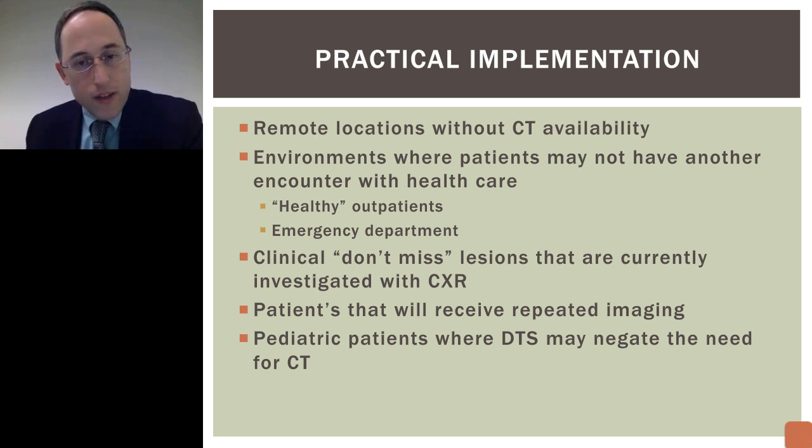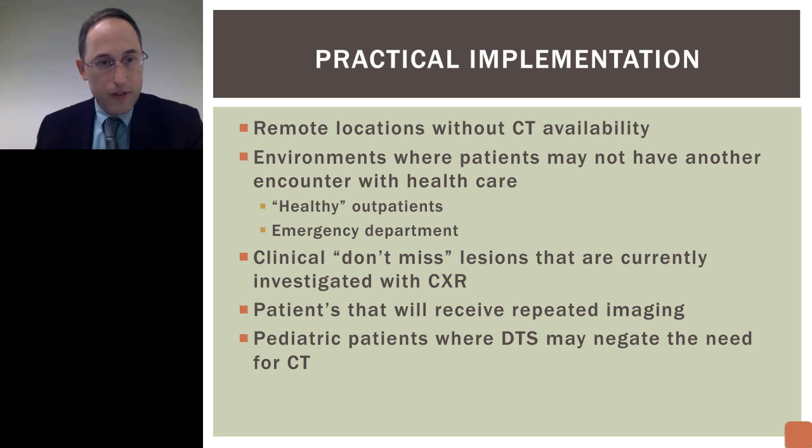Right? Another is environments where patients may not have another encounter with healthcare. This comes back to the picking of the incidental lesion. So healthy outpatients. Someone comes through, they have a problem, you take a chest radiograph, it's normal. That person will walk out of your office and not come back for years. So this is an opportunity to make sure you don't miss anything. All right. So healthy outpatients. Emergency departments is another one of these scenarios. Someone who comes through, they may not have another encounter with healthcare for a long time.